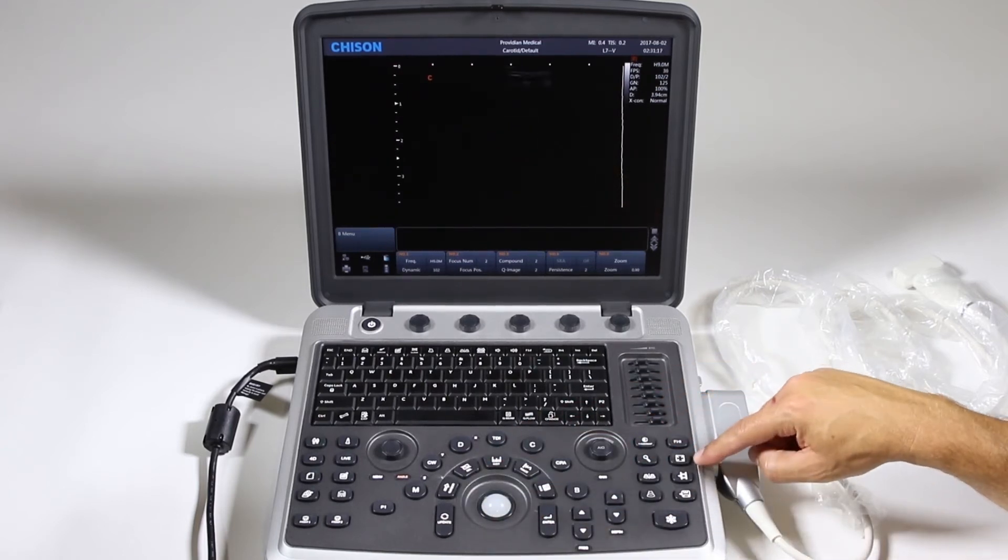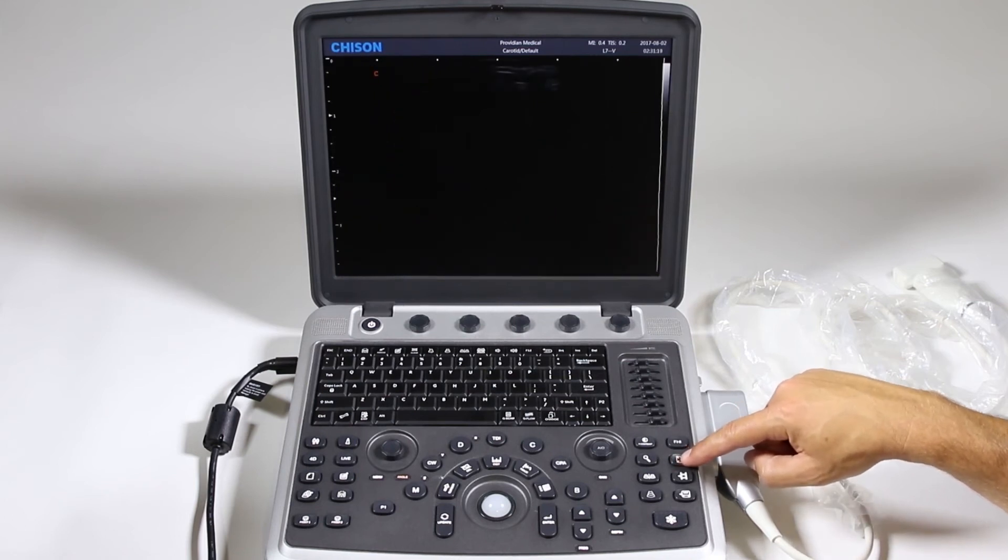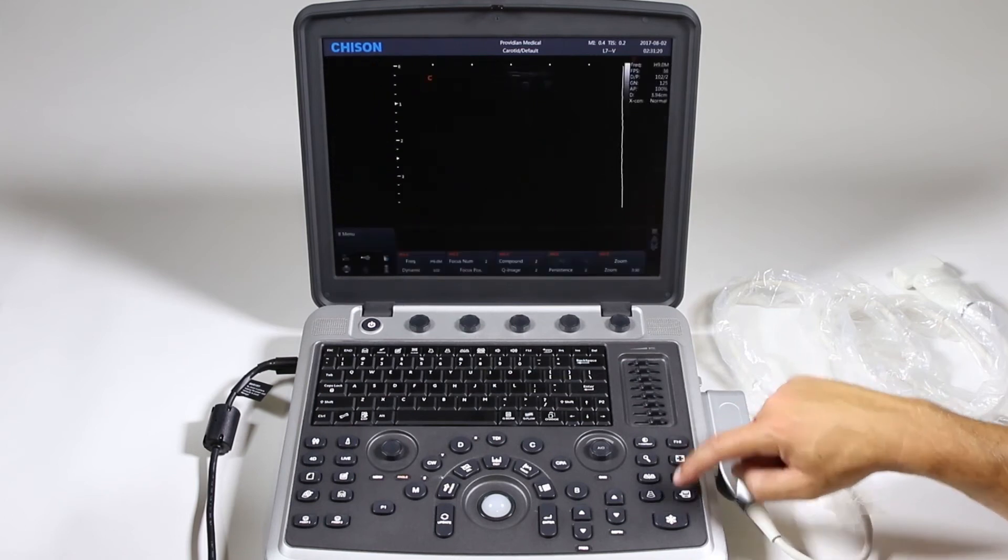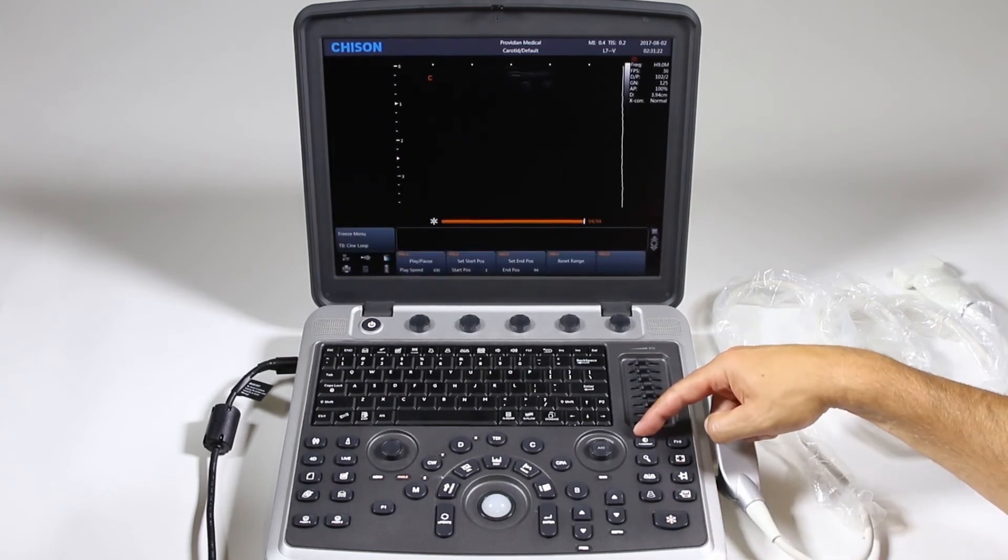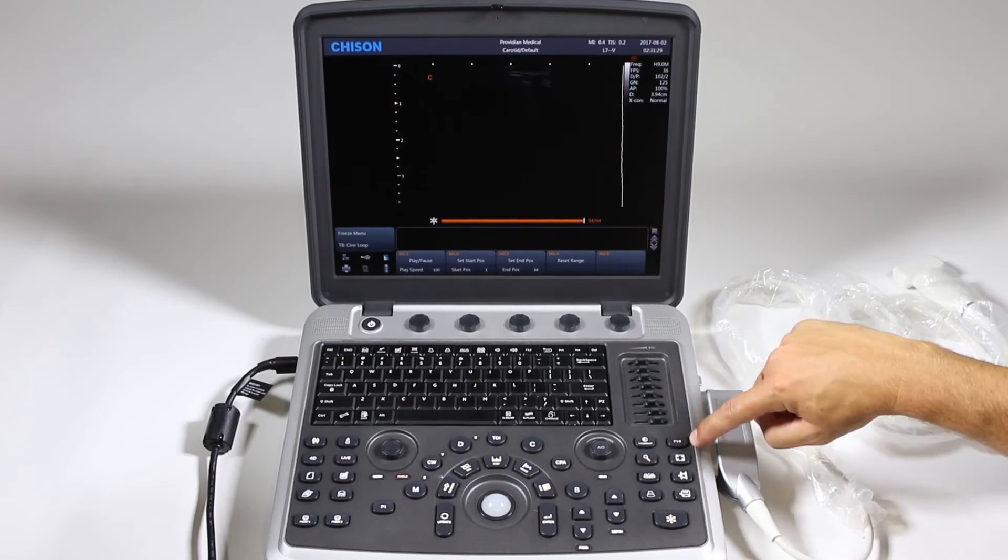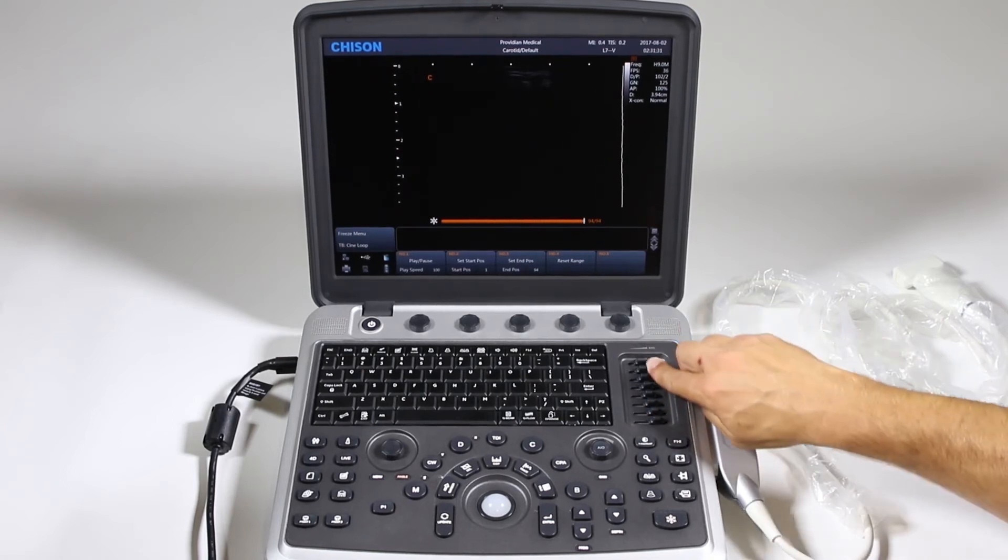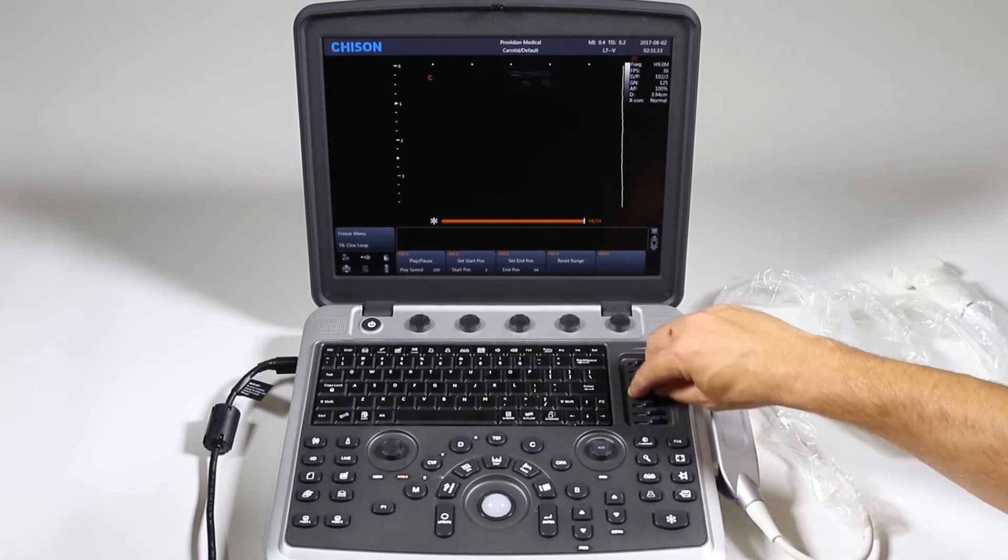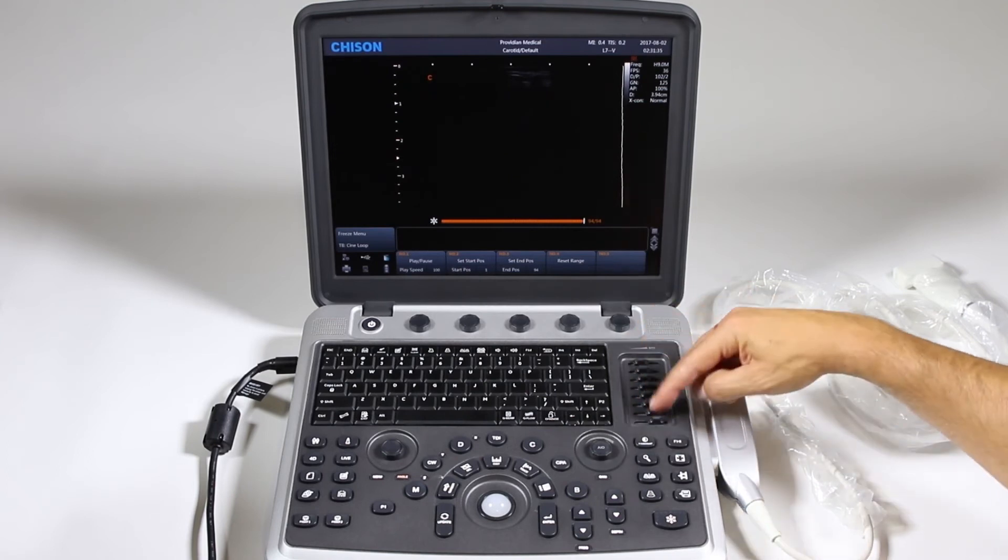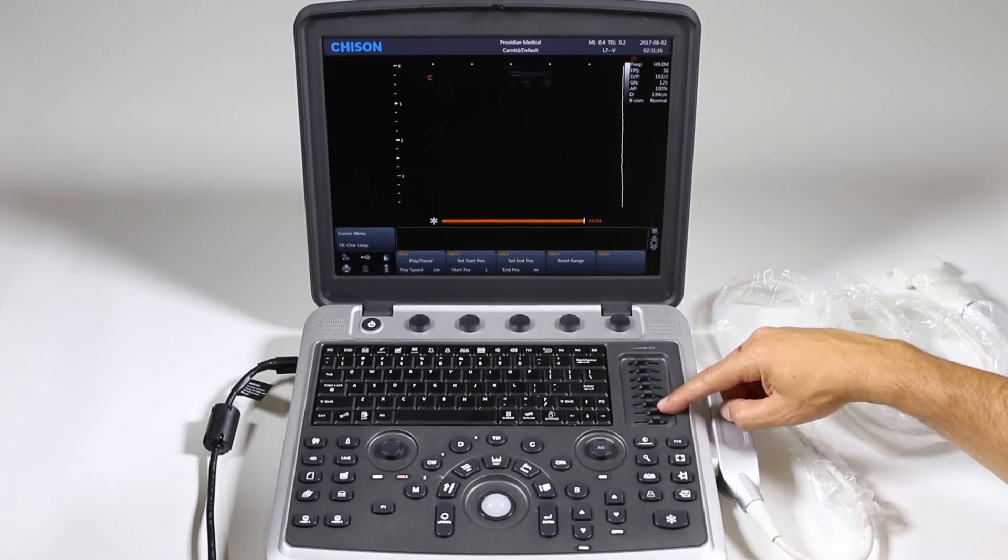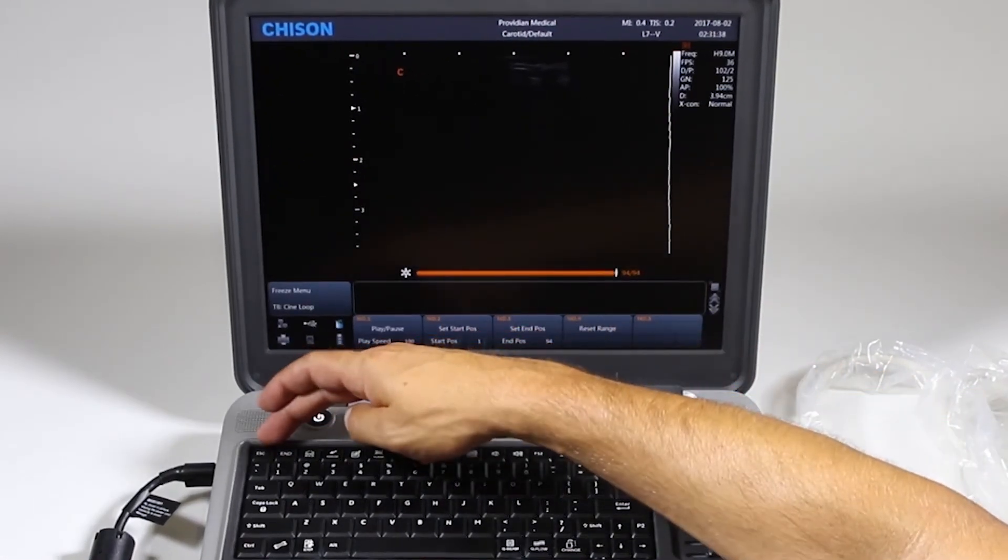So here we have a full screen option. You can go to full screen. X-contrast is an image optimization. This is for tissue harmonics imaging here. Of course, your TGCs, generally you want those towards the middle and going up as you go out there.